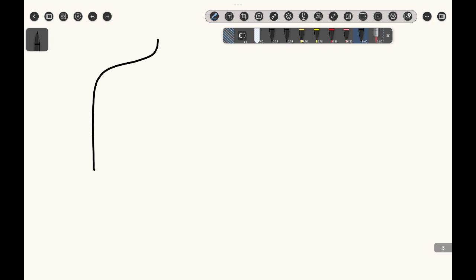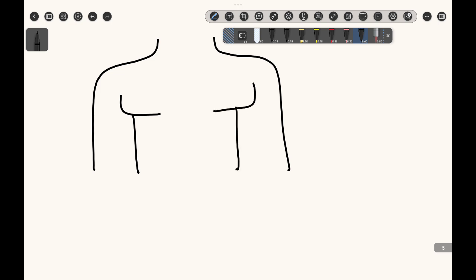Okay, so I'm drawing a diagram right now. Let's try to see that thing. If this is the sternum, that's how we place lead number 1, and that is lead number 1 here. Lead number 2 is placed somewhere here. The question is, I'm not just drawing it for the sake of it. They have specific positions.